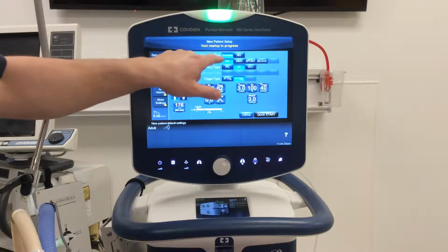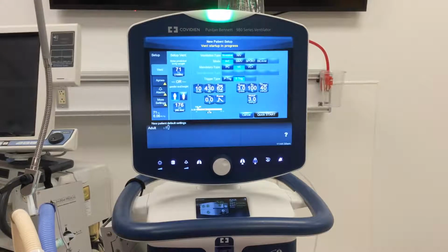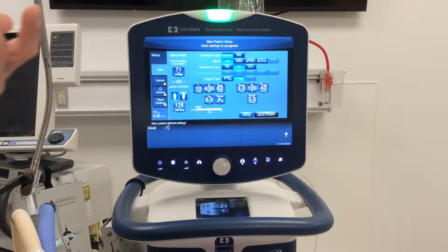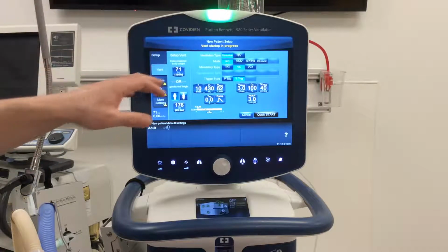Now, once we choose mode type, we're going to stick with assist control. This is what you see more often here in our area. And in adult care, this is typically what we're initiating most of our patients with, assist control, or CMV, as an initial mode of ventilation. We'll talk about the benefits of that here in a little bit.